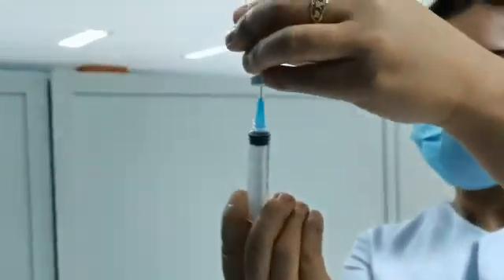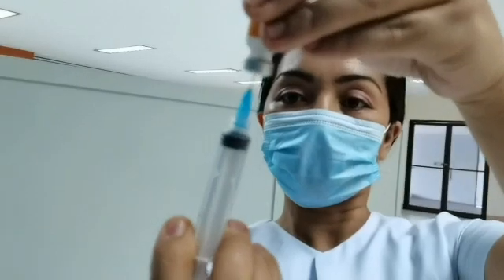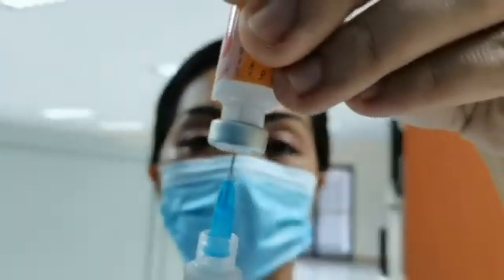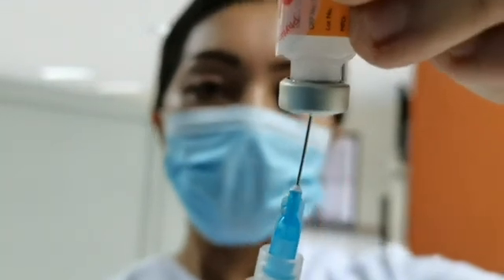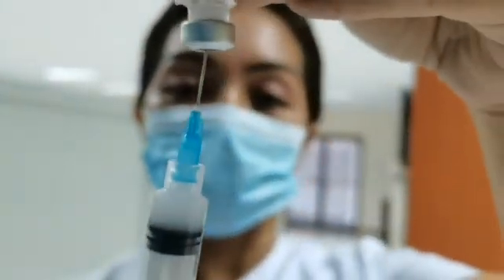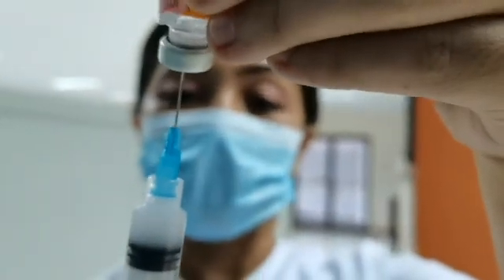Then you can adjust the needle if it is too long inside the vial, then get the exact amount of medication. The exact amount of medication you are going to withdraw is the result of your drug calculations. So the exact dosage of medication. So if it is 1 ml, you get 1 ml.